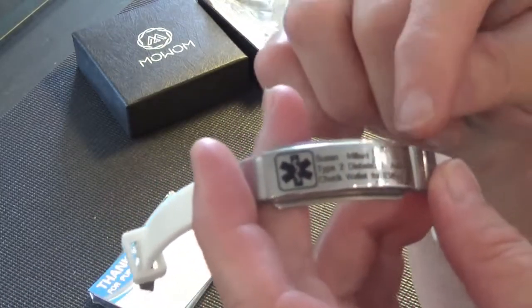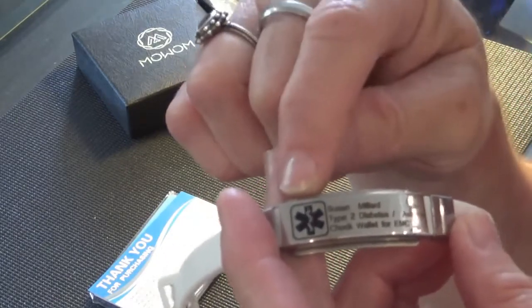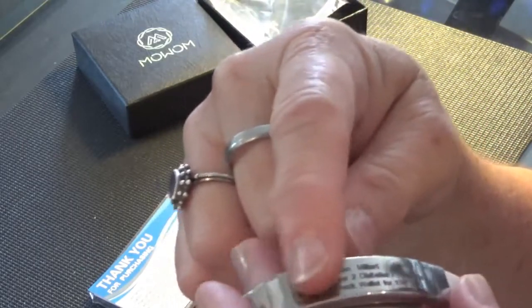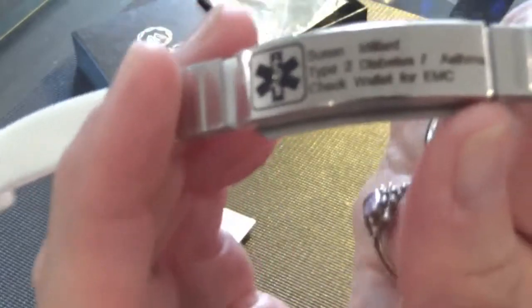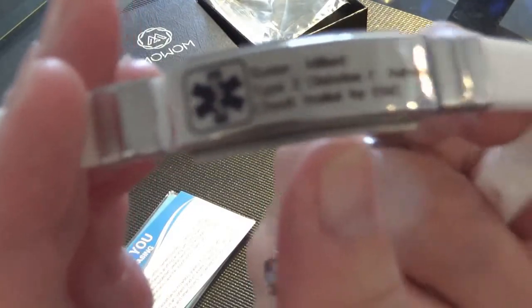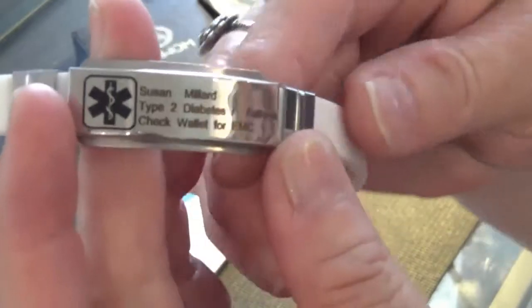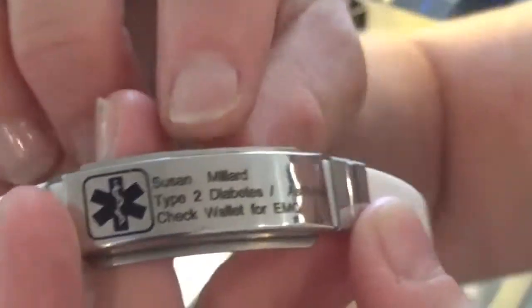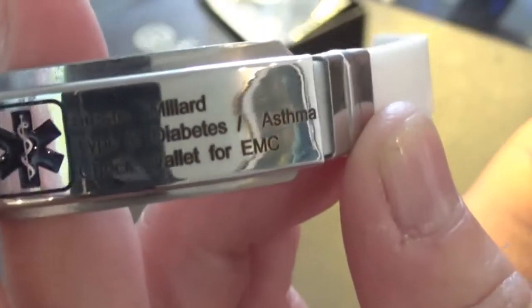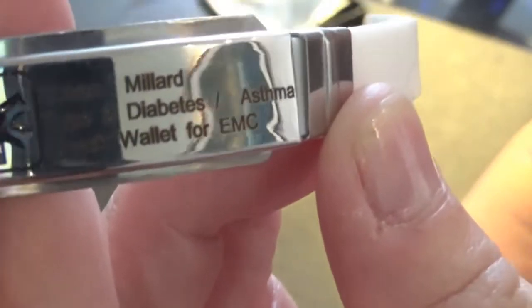They do have a similar bracelet that's all black with the engraving in white. I think should I buy one of these again, I will go that way — black background with white print — because in strong sunlight I find this one really hard to read. I also noticed they got all my information on here, but the engraving is offset by one line. If you have OCD, this will drive you crazy, but I've kind of accepted it as the way it is — at least it's all on there.